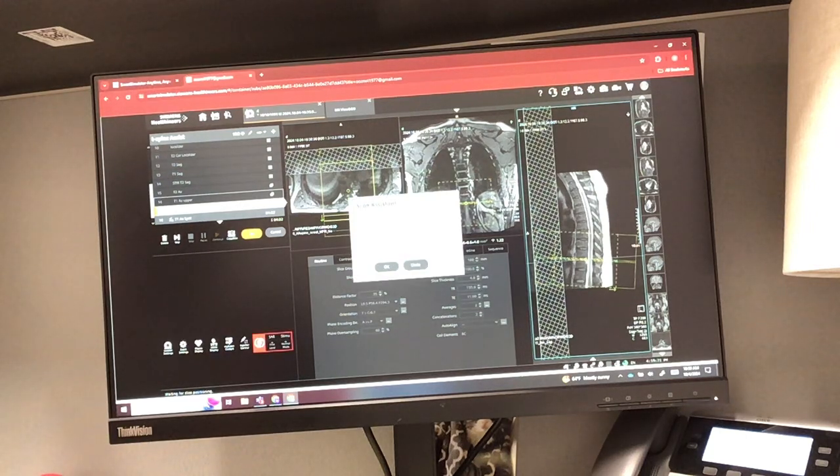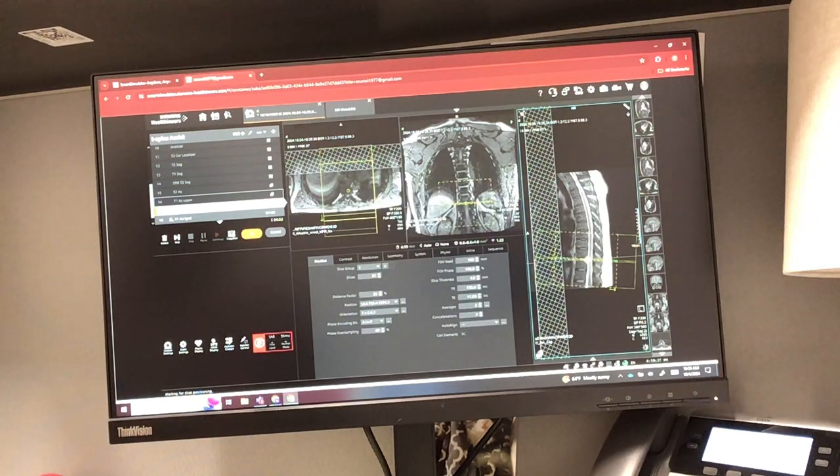So my upper stack, oops, my upper stack was down to this almost completely all the way through T8. You want the stacks to overlap because you would not want to risk cutting anything out, and typically then you could compose the two stacks together.